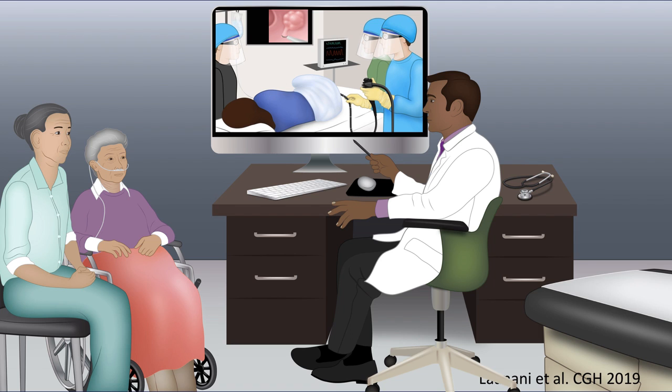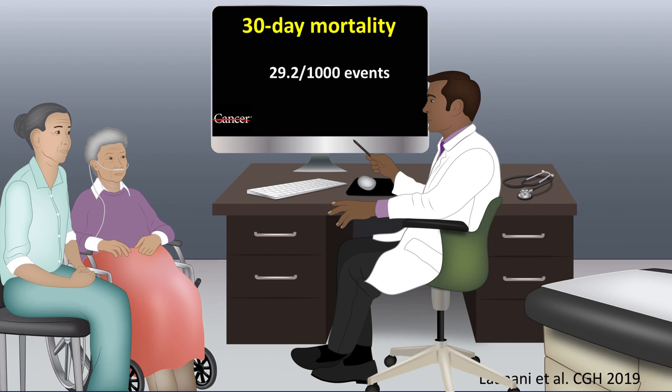The risk is also higher in the younger endoscopists with limited experience compared to senior endoscopists with a lot of experience. And this is important because once a perforation happens, the mortality is pretty high. 3 out of every 100 events leads to death.